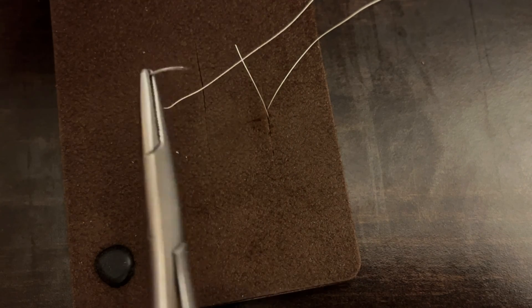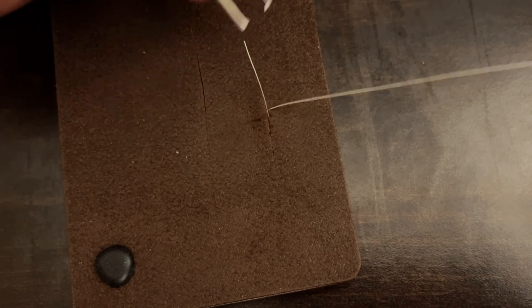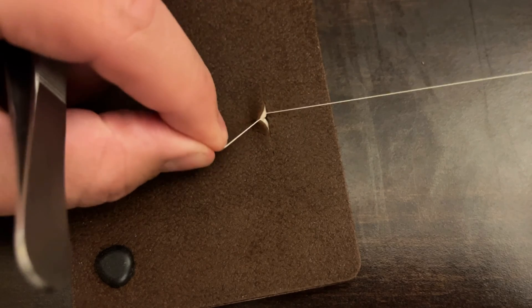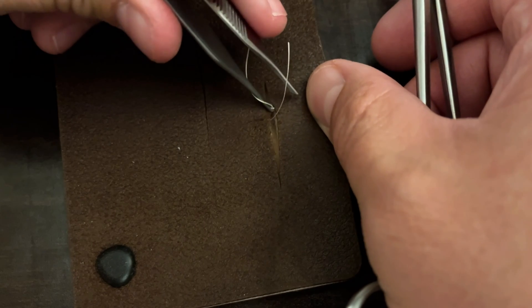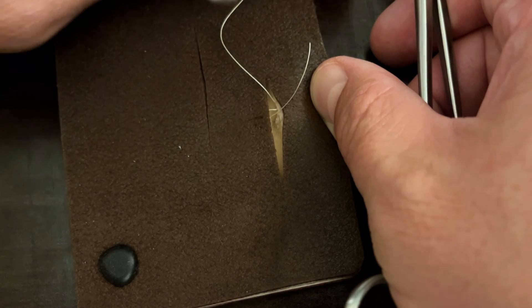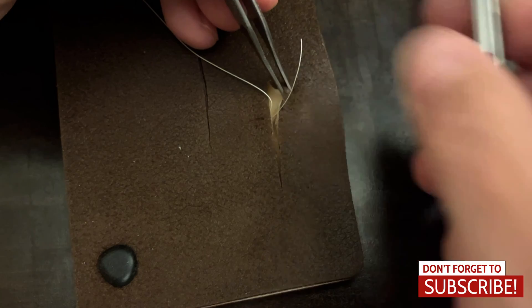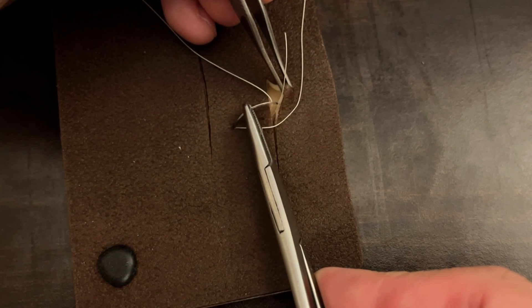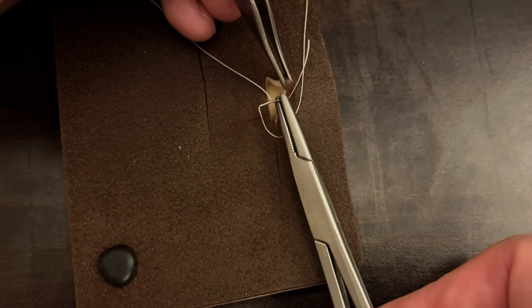I'm going to load my needle in a backhanded fashion so that I can now go superficial to deep. You want to do this exactly straight across from where you went through first, so that when you tie your knot it is going to be pulling straight across the incision instead of at an angle. I'm going to grab a hold with my pickups and enter on this side — superficial to deep — entering the dermis just deep to the epidermis.